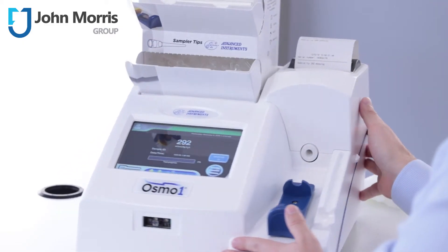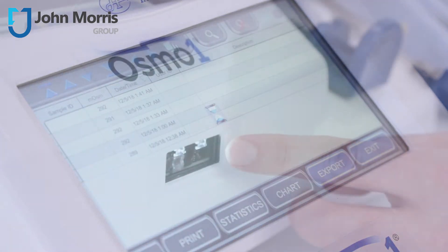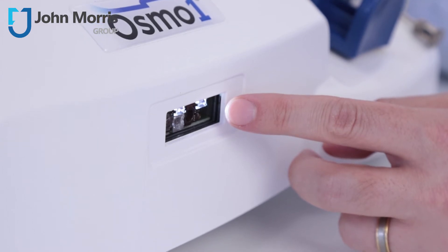The Osmo One features a touchscreen menu-driven operating system and an integrated barcode scanner for traceable sample identification and reduction of transcription errors.